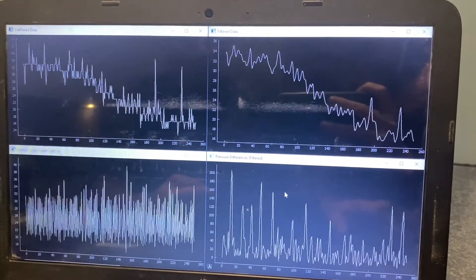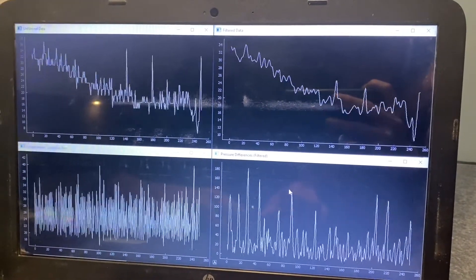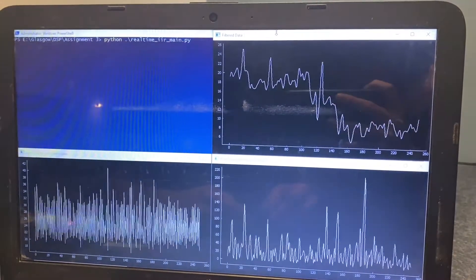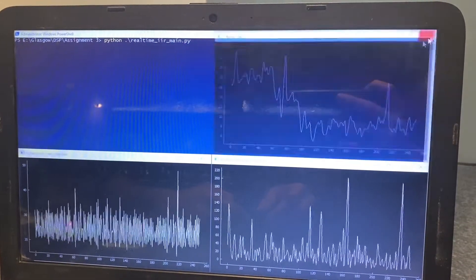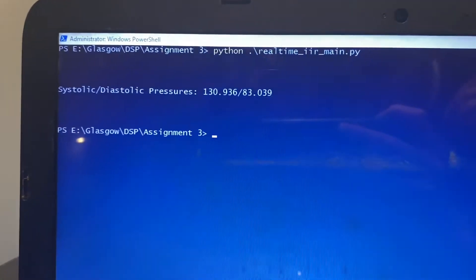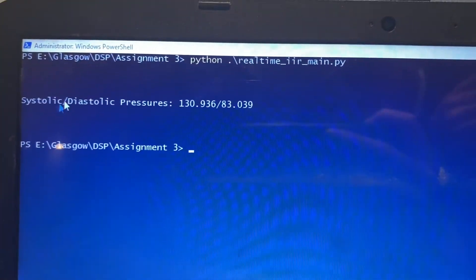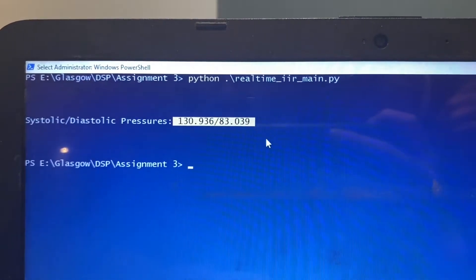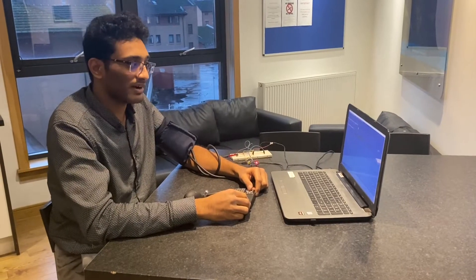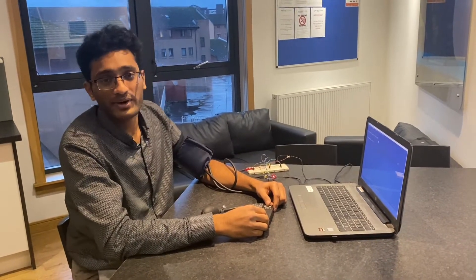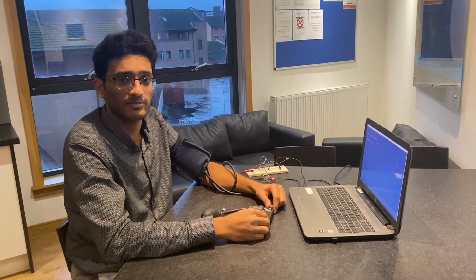After closing the windows, we can observe the blood pressure results. The readings are displayed as 130.936 mmHg systolic and 83.039 mmHg diastolic.